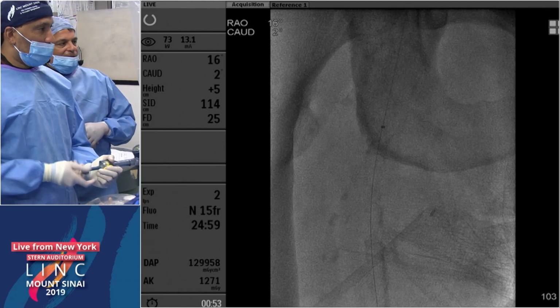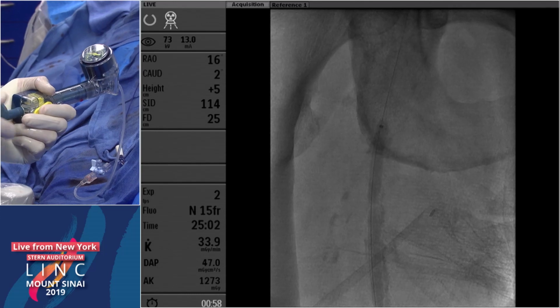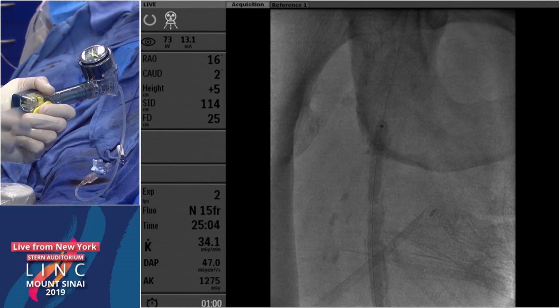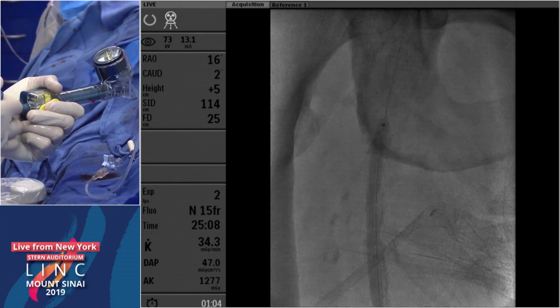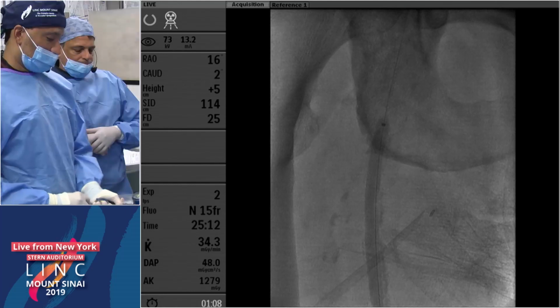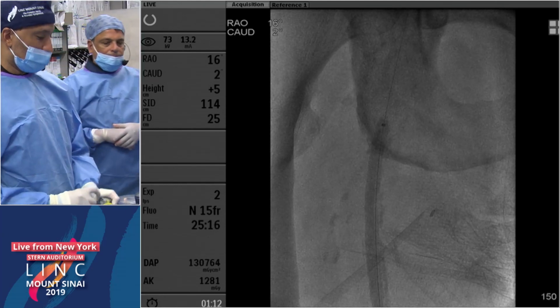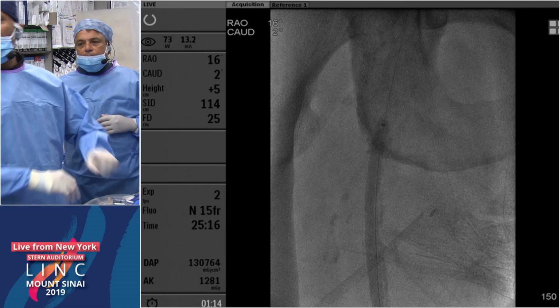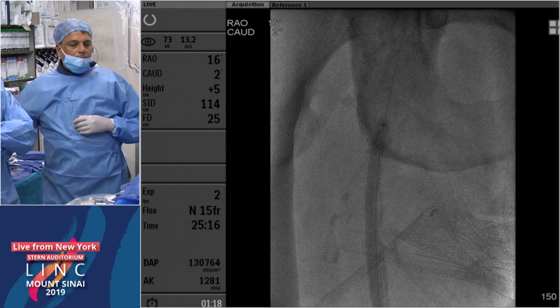How about you, Mike? Do you do anything different? You know what? Honestly, no, but I so rarely use them in my practice. So I will tell you that we would do our routine follow-up. I might be a little bit more aggressive with duplex ultrasound rather than just segmental pressures and Doppler waveforms in that setting. So I think I would include that as part of the surveillance.